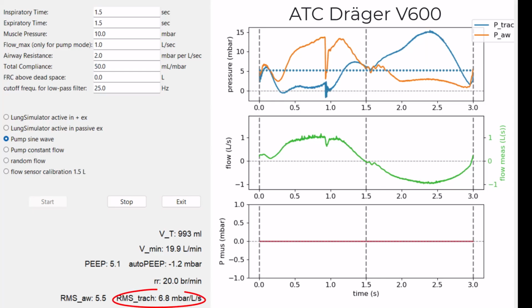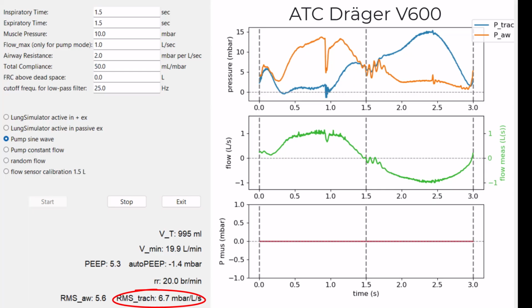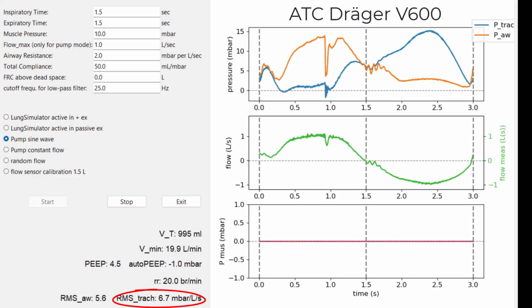And the effective resistance as expressed by the standard deviation of the tracheal pressure divided by the standard deviation of the flow, that's the RMS tracheal pressure, and that's the effective resistance. So it's 6.7 millibar per liter and second. So it decreased from 10.9 in T-piece trial to 6.8. But as you can see, it's not really in a very effective mode. So that's only about 40% of tube compensation.